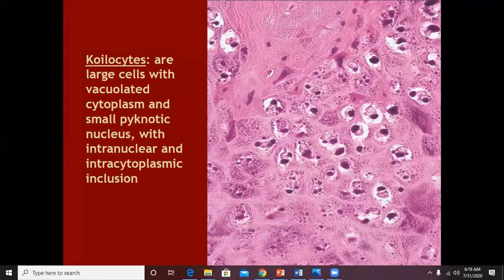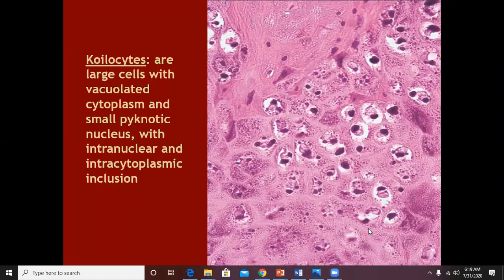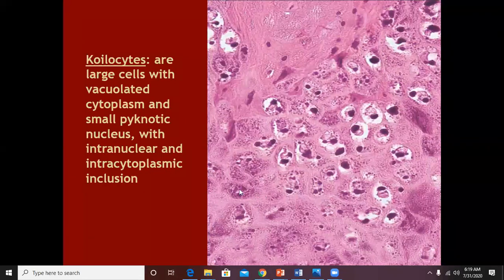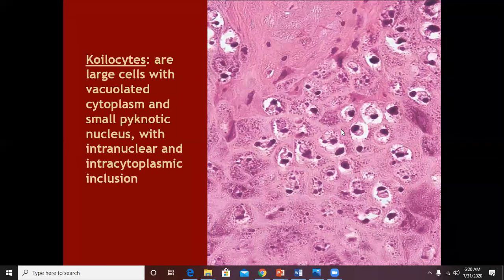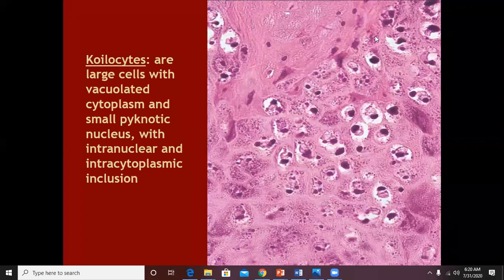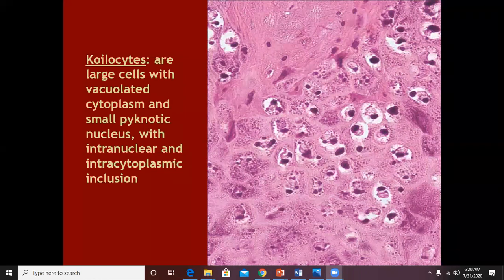In addition to hypergranulosis, what else you would see in the granular layer is vacuolation of cytoplasm. A normal stratum granulosum cell has a lot of granules within the cytoplasm. But in warts you can see vacuolation or a halo surrounding these stratum granulosum cells — this halo is the feature developing before true koilocytes form.